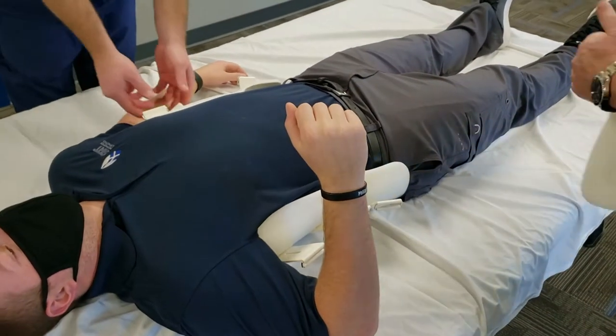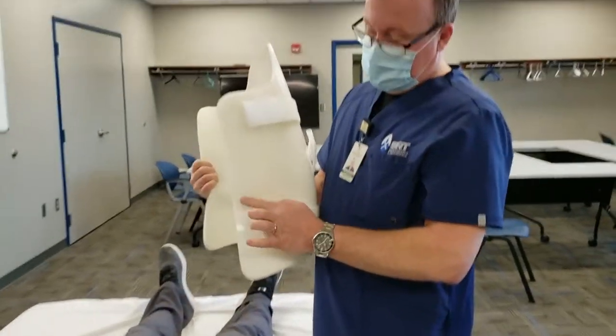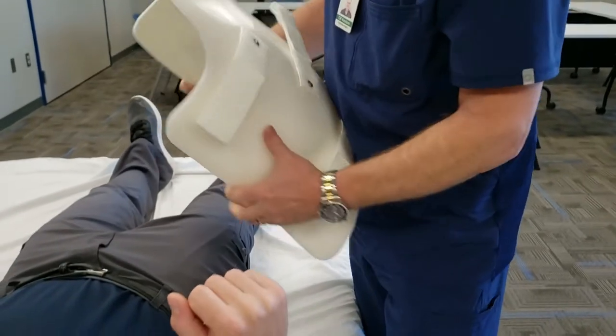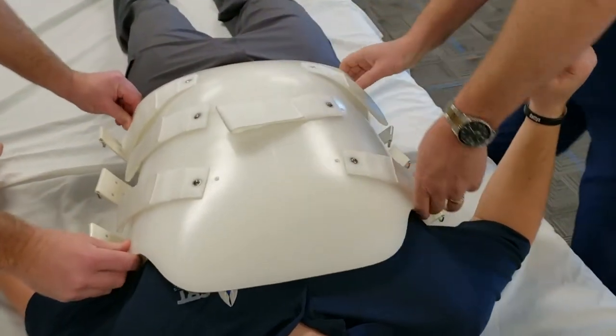The front typically goes over the back. You want to line the waist groove in the front up with the waist groove in the back. We're going to put this over and line it up.